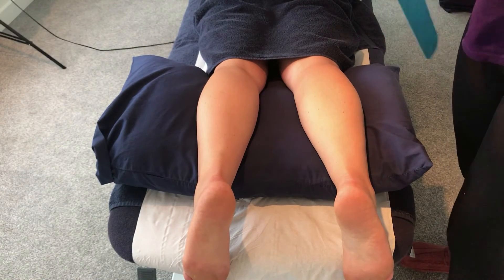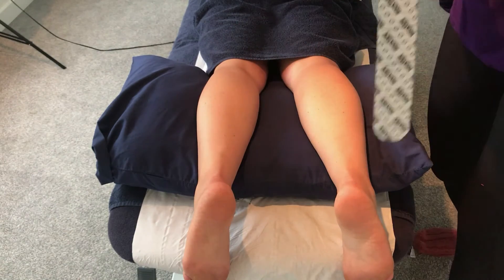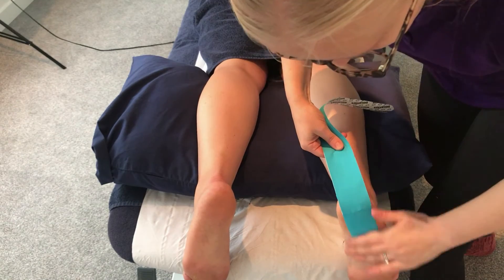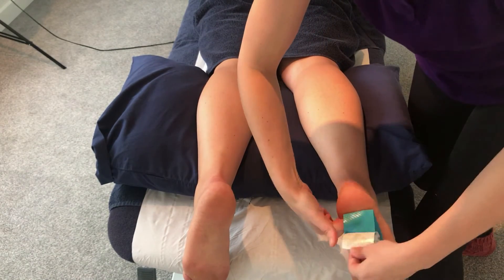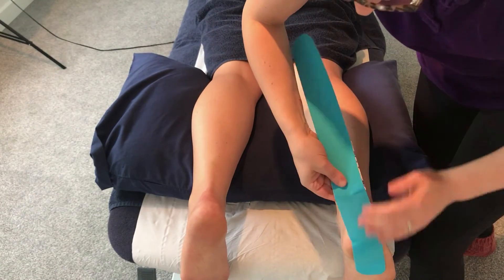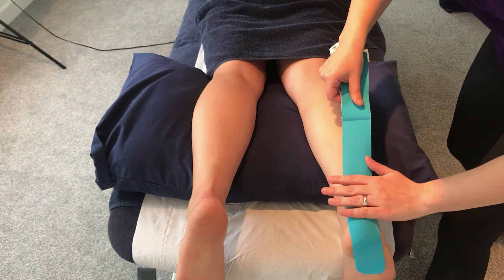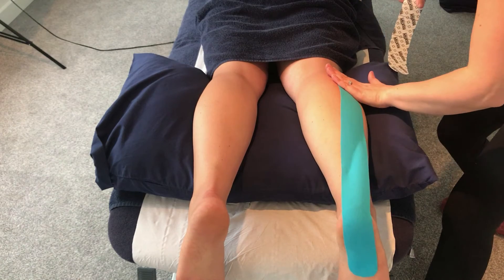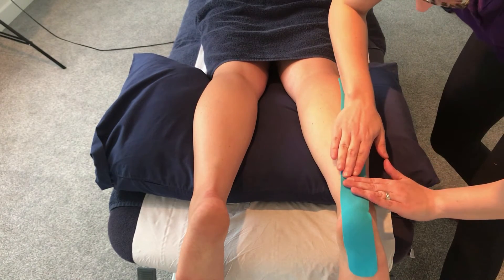Begin by taking off the tape. We want a long anchor because it's going to cover the whole of the calcaneus and attach underneath the foot. Relax the foot to attach the anchor. As we peel off the tape, we want light tension through the tape with the tissue on a stretch. Get the client to go into dorsiflexion, with light tension on the main part of the tape. Relax the foot for the base, then rub the tape down to adhere it.